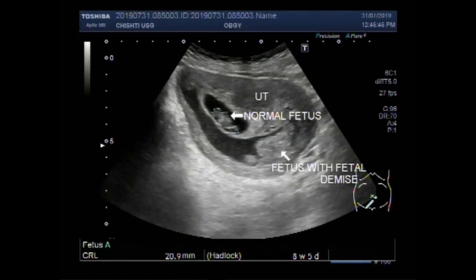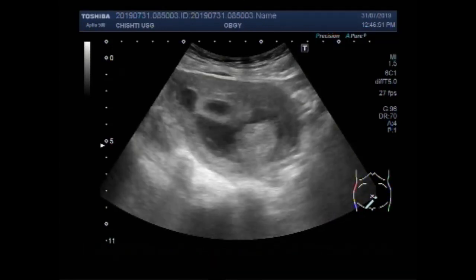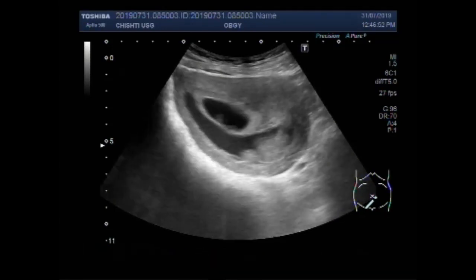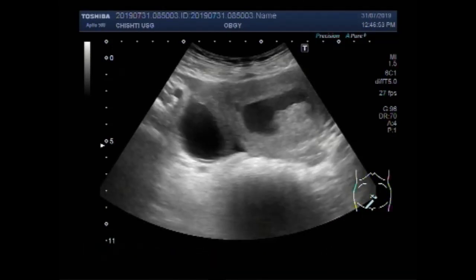Dear viewers, I hope you are all fine. This ultrasound video shows twin pregnancy.